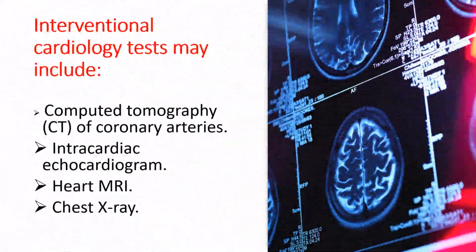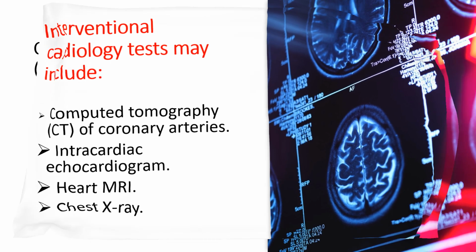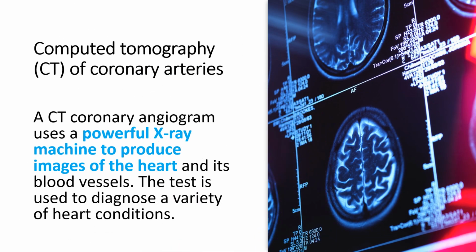Interventional cardiology tests mainly include computed tomography, intracardiac echocardiogram, MRI, that is magnetic resonance imaging, and chest X-ray. Computed tomography of the coronary arteries uses a powerful X-ray machine to produce images of the heart and its blood vessels. Mainly it helps to diagnose a variety of heart conditions.